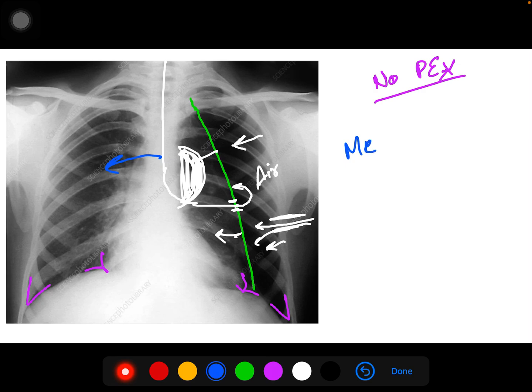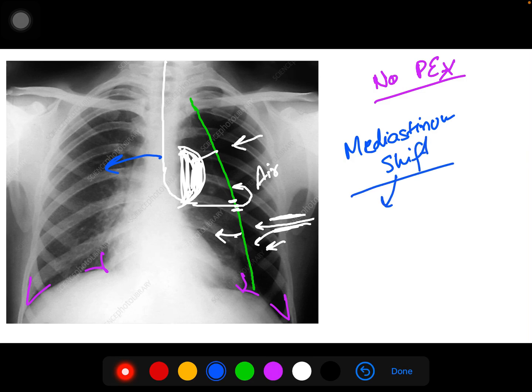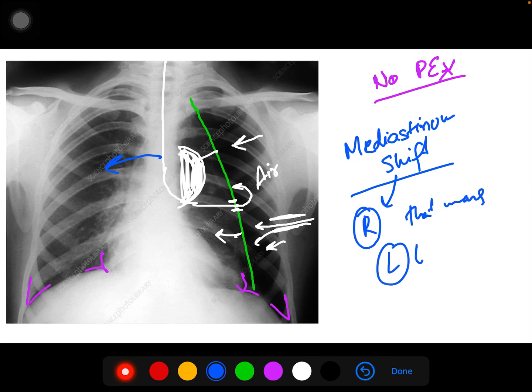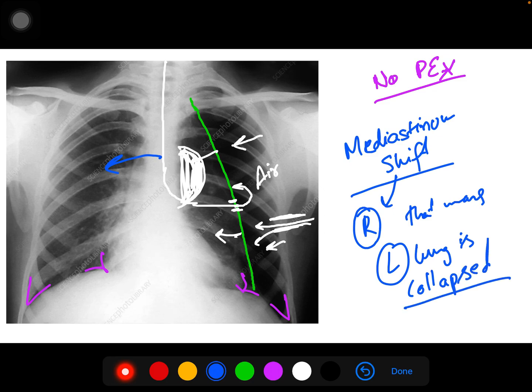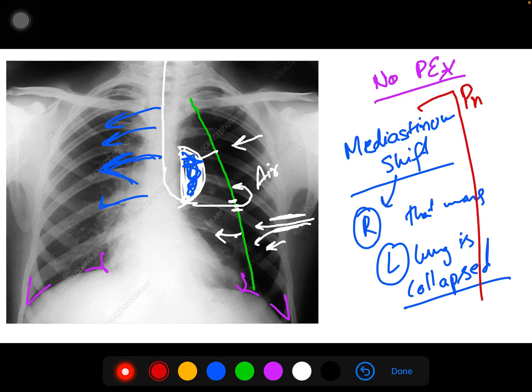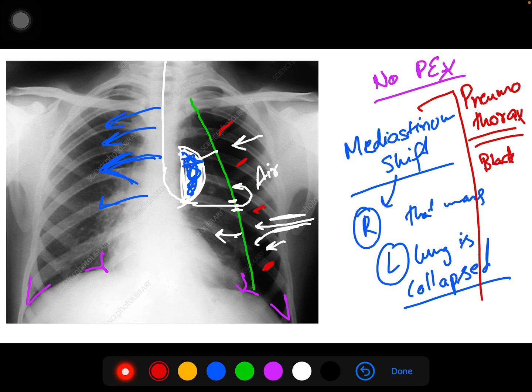When that happens, there is a mediastinal shift. If the mediastinum shifts to the right side, that means the left lung is collapsed. So in the X-ray the mediastinum will shift towards the right. This is a case of pneumothorax, and the key finding here is the blackness — nothing seen but blackness, kind of translucent or transparent.